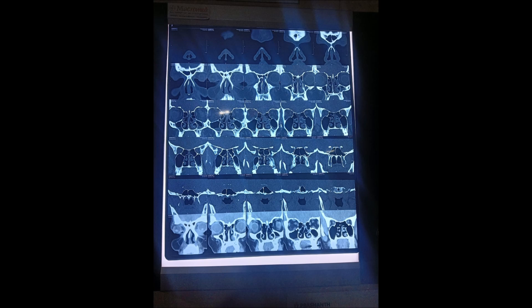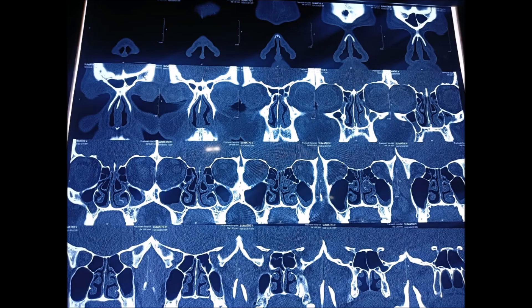You can see the coronal CT scan images. Please watch these videos on a big screen. If you are watching on mobile, please pair it with a big TV screen and watch.